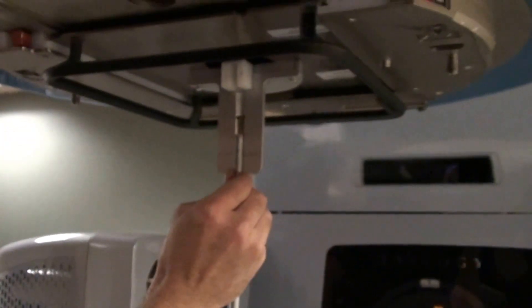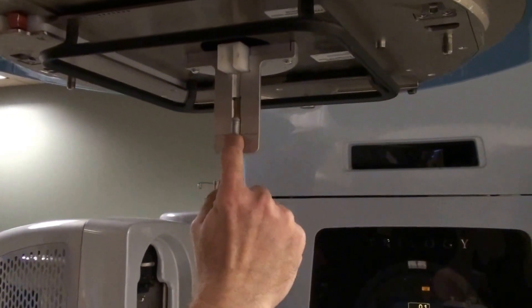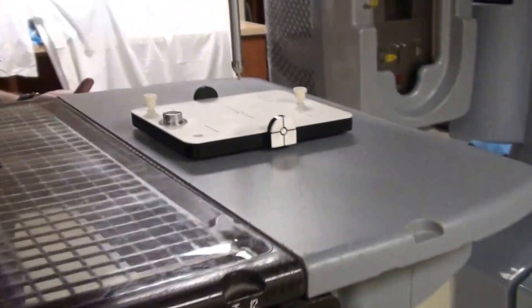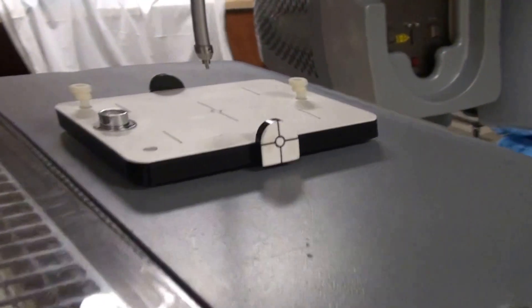We're checking to see if we're on at 100. You want to be straight on and make the 100 line line up with the etched line on the device. Next, we need to raise the table up until the plane of this device just touches the stick.